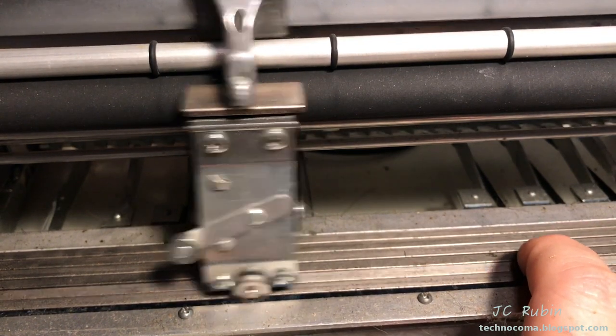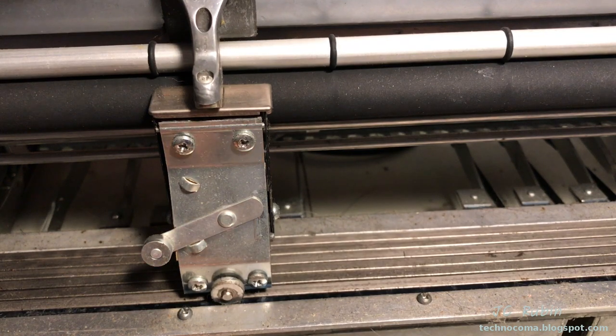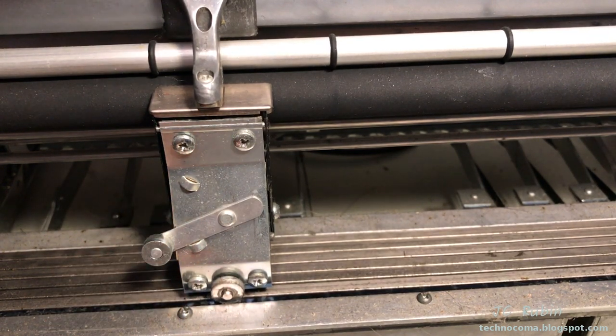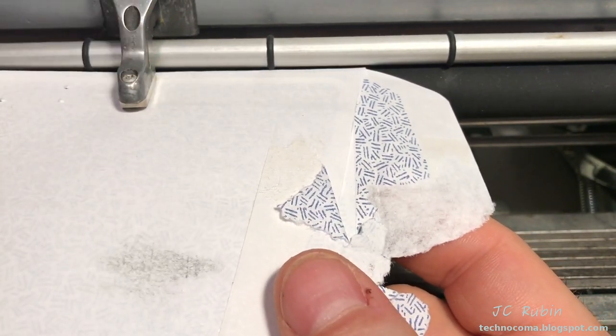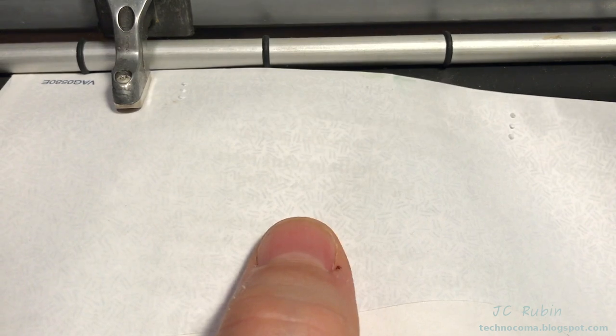I wanted to point out some of these finer details before getting started — the dust, caked-up grease, and other issues throughout the unit. I do take an envelope and test to make sure all the pins work — left side and right side make up the six dots. The mechanics within this are working well.